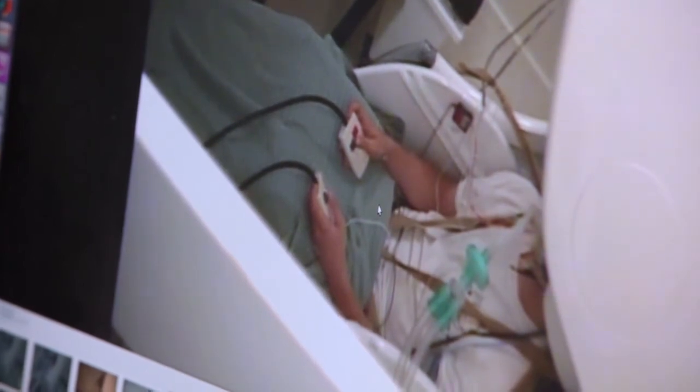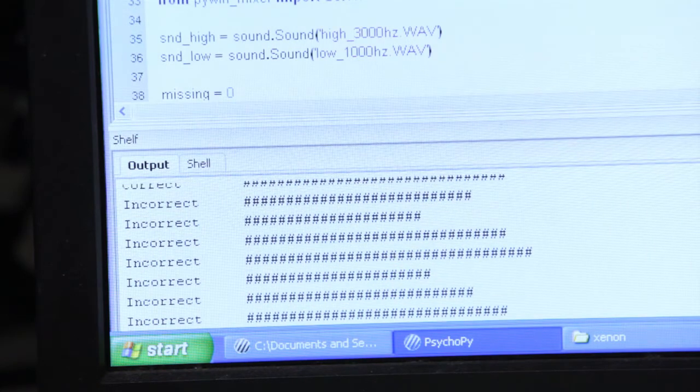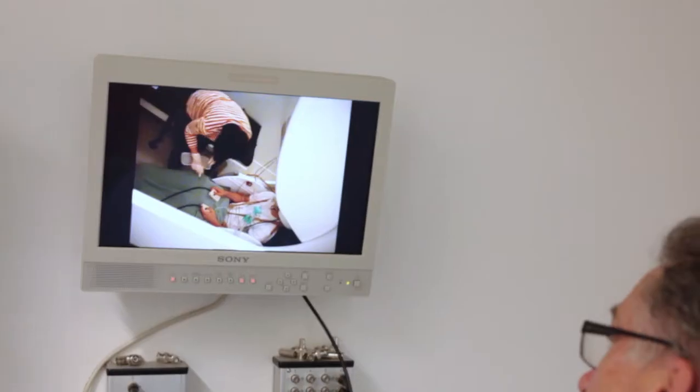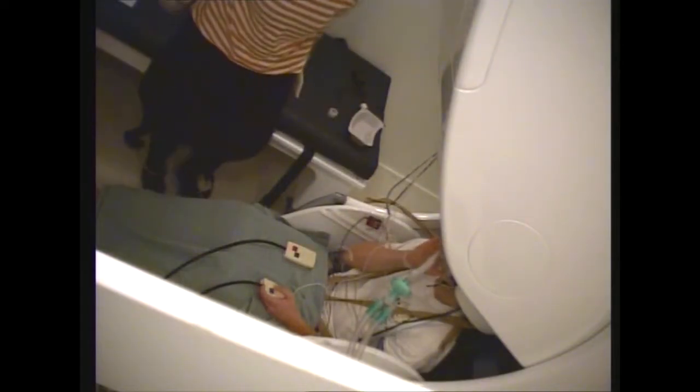Because at the highest xenon level, in which loss of responsiveness is achieved, airway obstruction can readily and unexpectedly occur, subjects need to be closely monitored and continuously assessed by qualified personnel, both inside and outside the MSR, for all necessary action to be taken immediately.